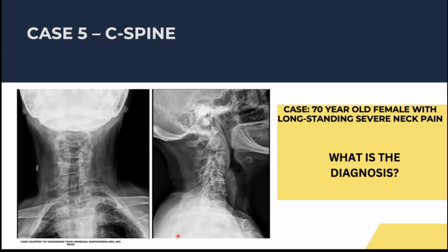So if you're looking at that, does anybody know what the diagnosis could be? I mean, I've given it to you sort of, but it's a very long word. It's not that long, but it's longish.